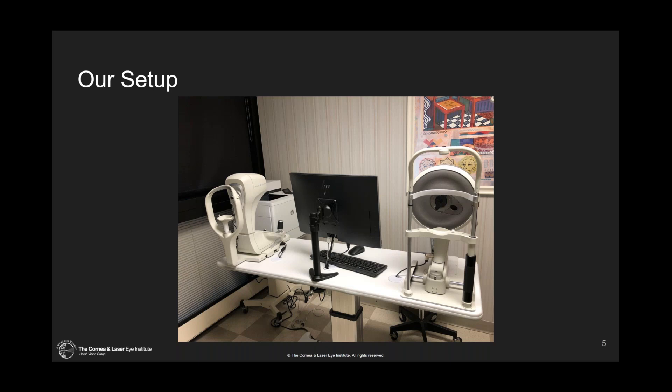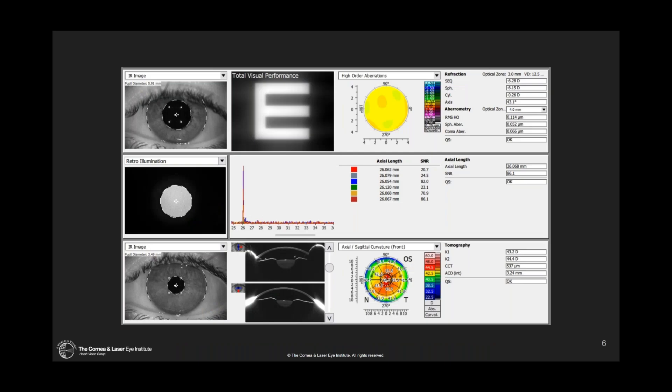There are a variety of different algorithms on the device that correlate multiple different metrics together to give us comparisons to normative databases and tell us when something's out of the ordinary or track when something has changed. One of the newer levels of utility is the ability to map the cornea and the sclera together for the purposes of fitting contact lenses.